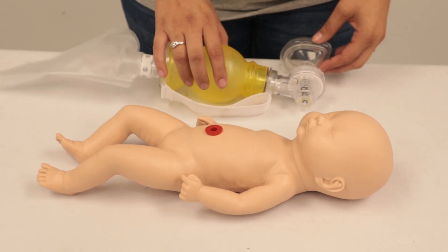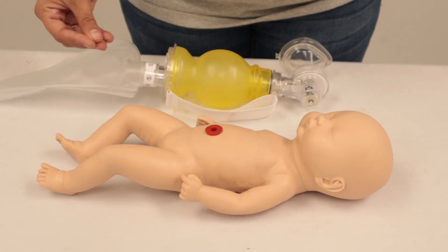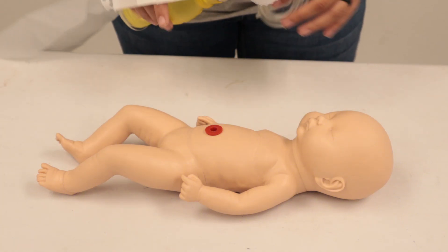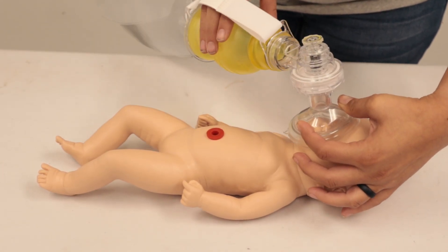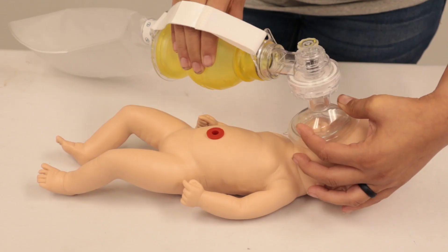If the pulse is less than 100, we're going to begin positive pressure ventilation at a rate of 40 to 60 breaths per minute. Initially, we're going to do it only for 60 seconds. So we're going to take our infant BVM and just start doing it - tiny little CE clamp - and just ventilate the patient, about one every second to second and a half.